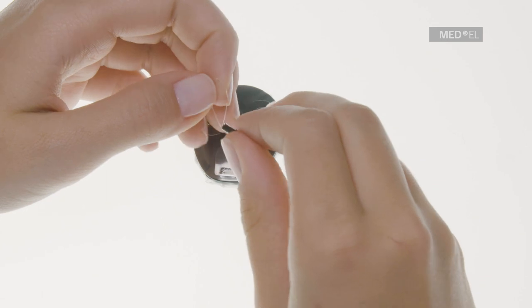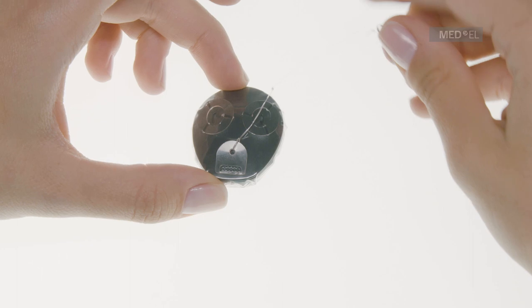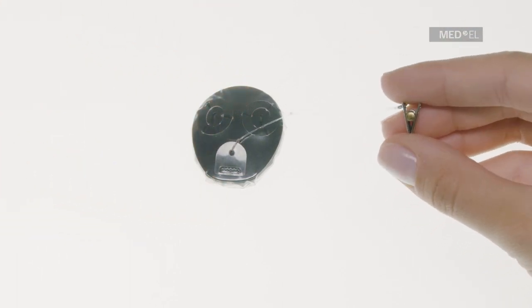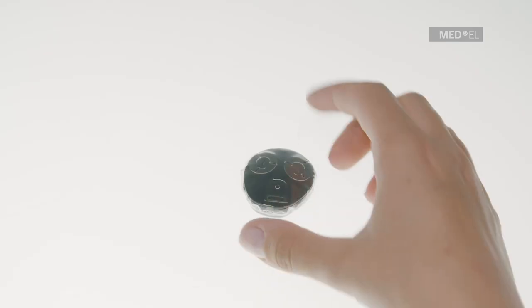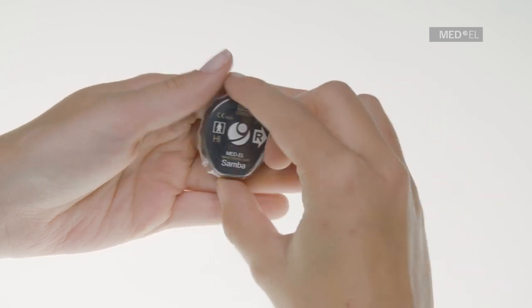Pull the loop of the string through the hole of the semicircular flap and pull the end with the attachment clip through the loop. Your Samba with Waterwear is now ready to use. Position Samba with Waterwear over the implant. Fix the audio processor with the attachment clip and enjoy your water activities.